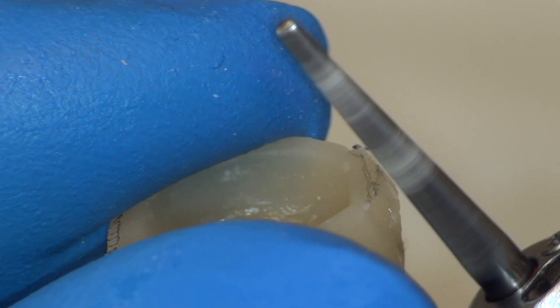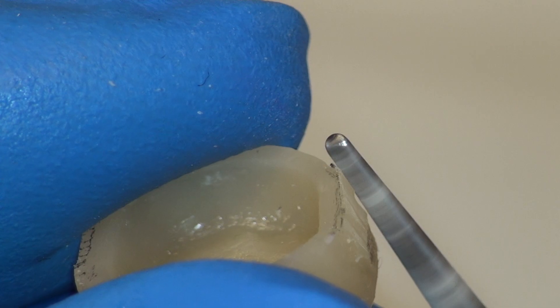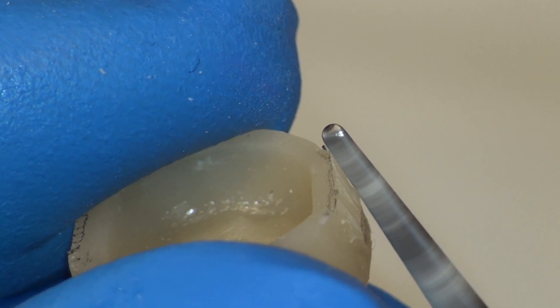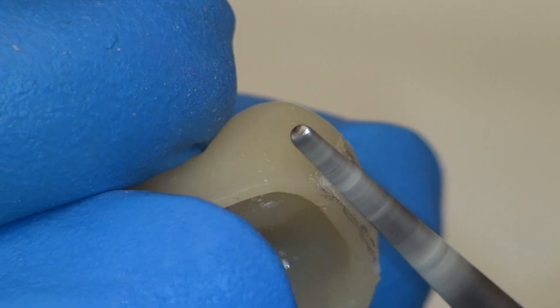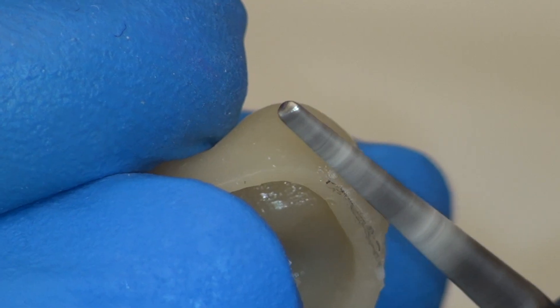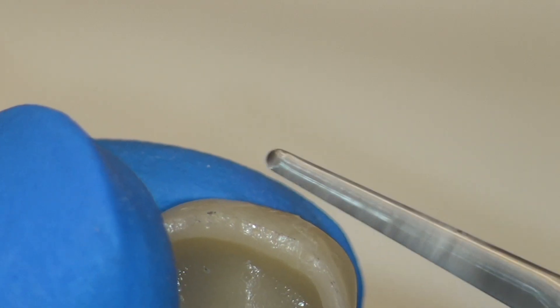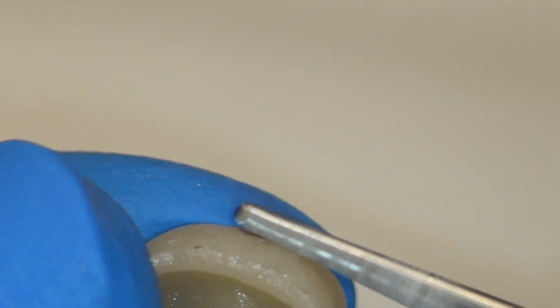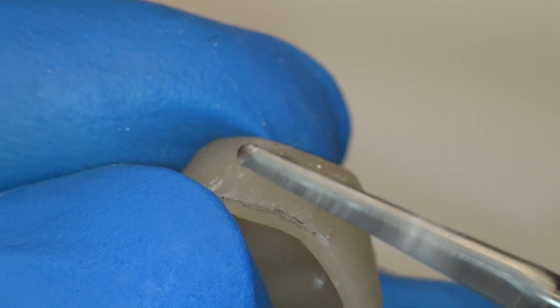With our finish line clearly marked, trimming becomes easy. This trimming is done with a small straight e-cutter at 40,000 rpm. Evaluate from multiple views to ensure that all excess is removed and a smooth contour. Be careful not to remove the interproximal contact that we marked with the pencil.